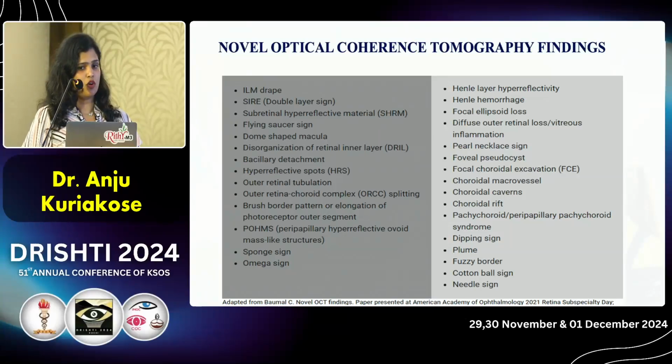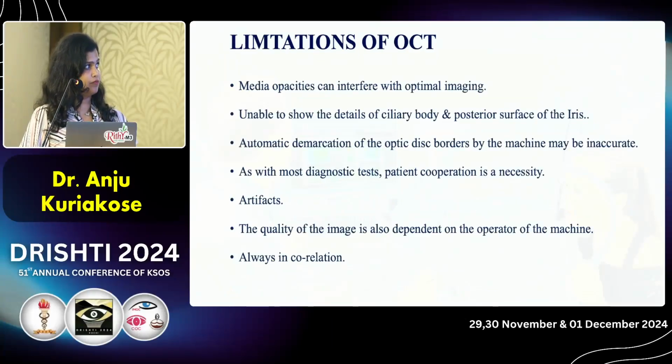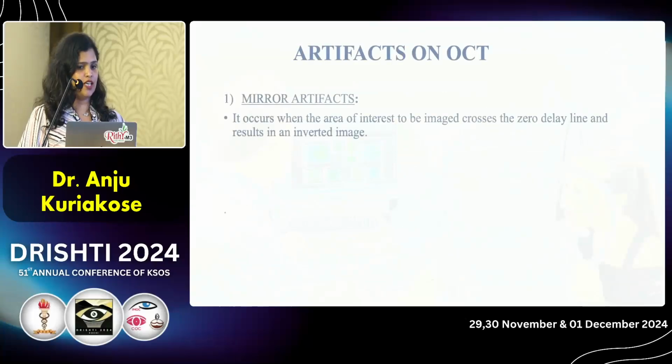So these are the common newer findings which are discussed. You can take a picture if you want. These are advantages: non-invasive, non-contact, more repeatable for the patient. So limitations are the media opacities and artifacts.